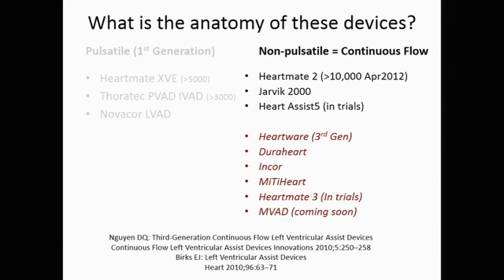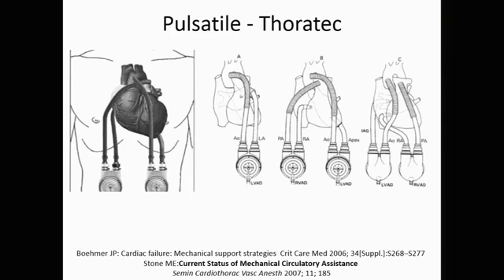The Heartware is a third generation device that's out there. The HeartMate 3 is in clinical trials. It's likely to be a major player, and the MVAD's also in clinical trials. This is the Thoratec device, which we used to implant a lot of at my shop.